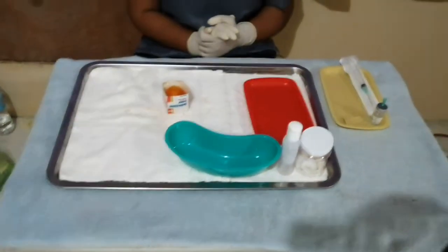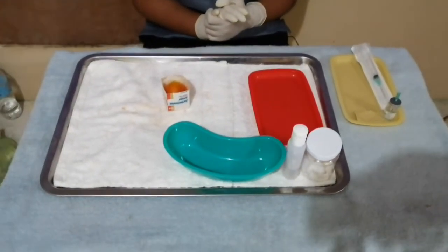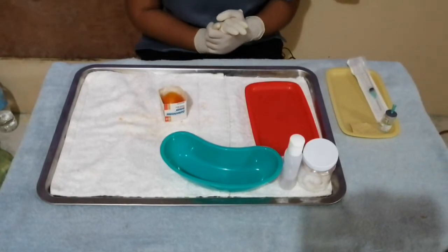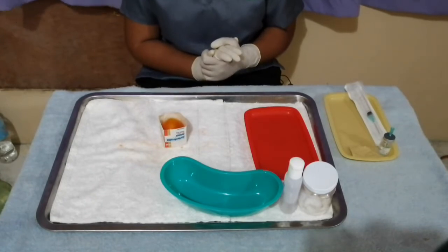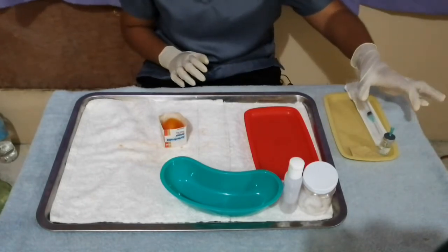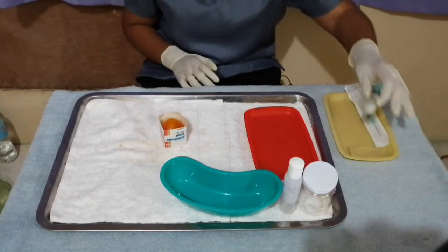The first procedure we need to do is to verify the order of the physician, comparing it to the medication ticket prescribed by the physician. Next, we're going to obtain and assemble all the equipment, the needle and the syringe, into the injection tray. Next, we get the drug from the patient medication box and check it with the medication ticket.